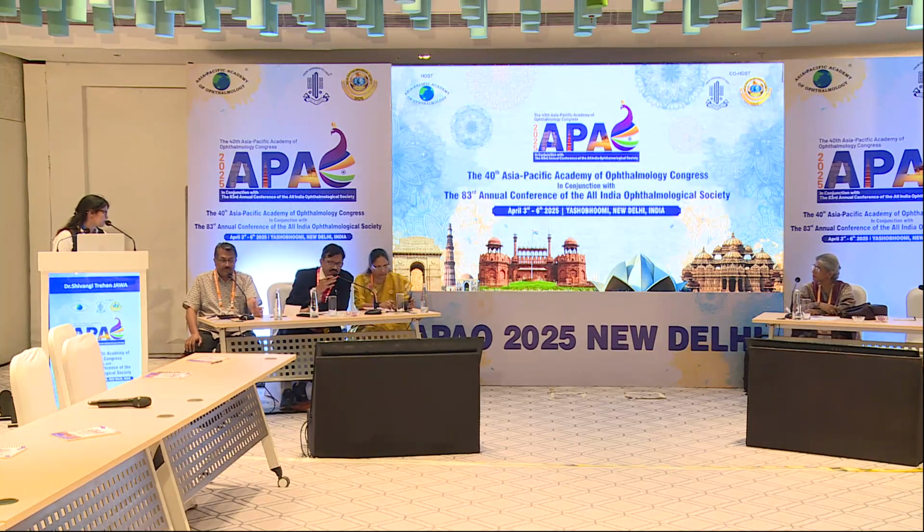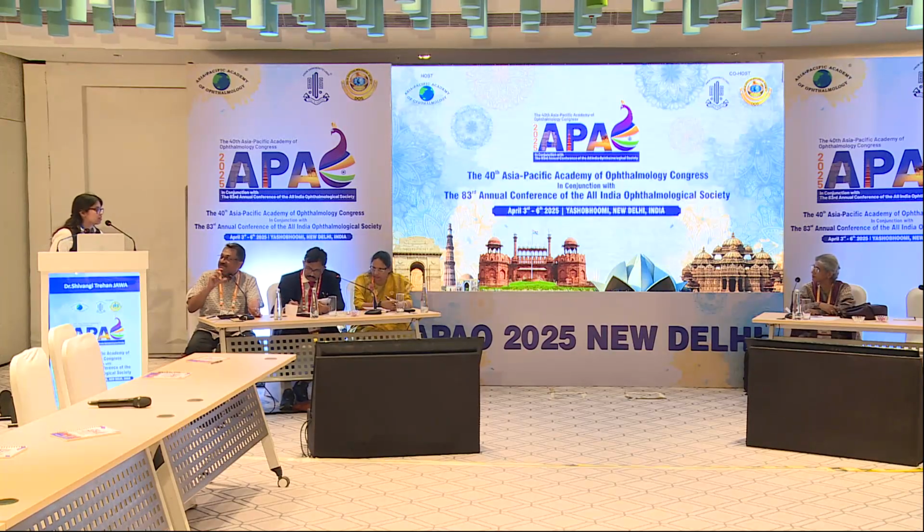If a patient comes with diminution of vision, then you will go for OCT. What is the point in going for an OCT where there's no significant change, from 217 to 219, in between going to 222? Do you think that is a significant macular edema? No, that's not significant, sir. Basically, we wanted to see if any significant edema was found in any of the patients.